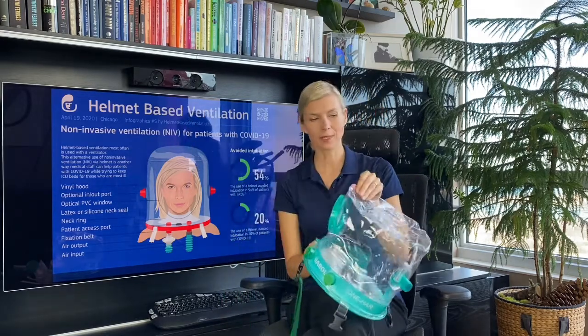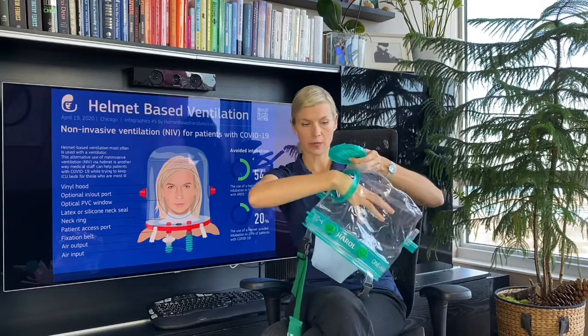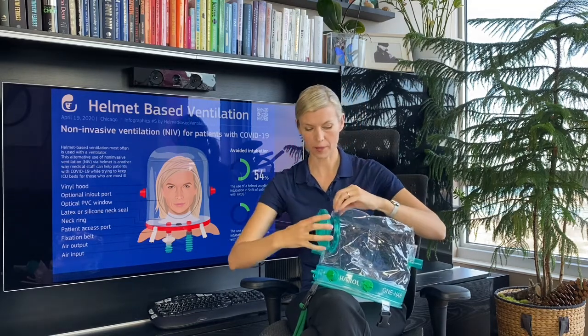The patient access port is just an easy top that screws on, and you can fit your arm in here for patient care. The top also has an anti-asphyxiation valve — this membrane will open when pressure is about two centimeters of water and let ambient air enter the helmet. When closing this port, you want to really tighten it until you feel a little click, which means the port is secured and won't fall off.